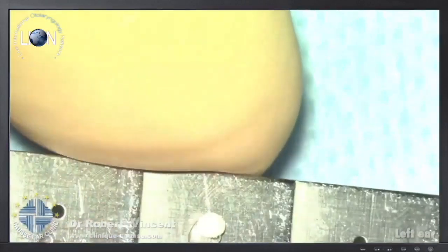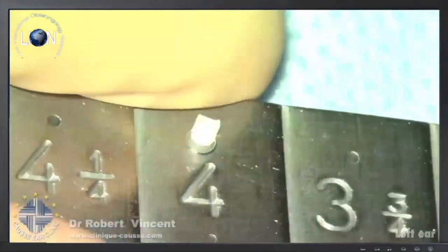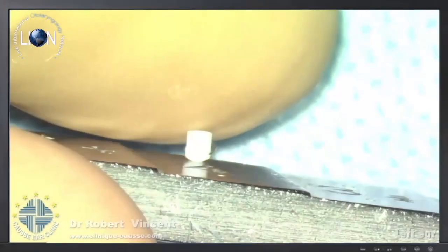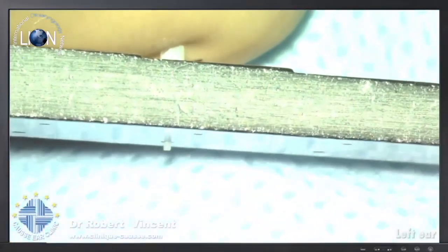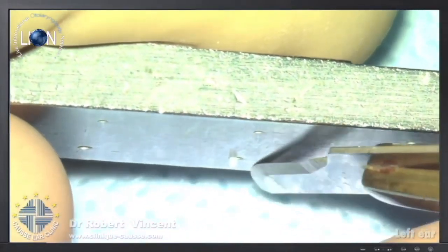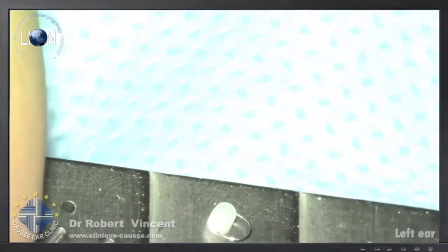In that case, I will use the bucket prosthesis because the incus was short. I will talk about this prosthesis a little bit later, but usually I use this one. I'm not going to attach the loop around the incus, but you can see there's a hollow head. And then I will cut the prosthesis in the same way because this is made in Teflon. Again, it's a 0.4 millimeter Teflon prosthesis.